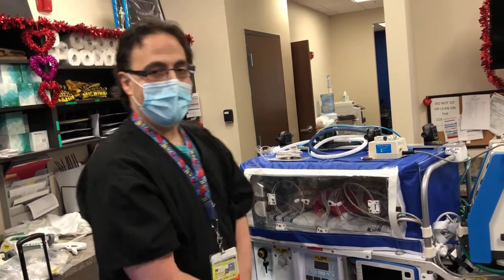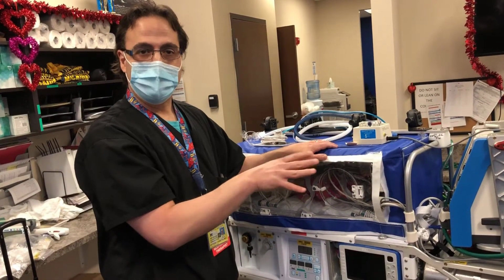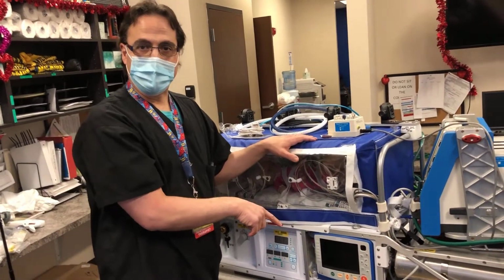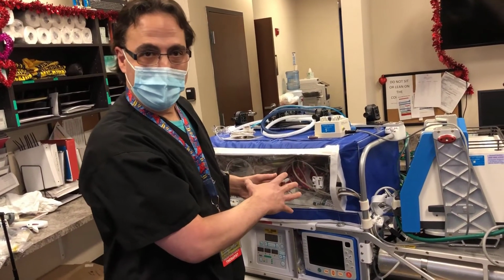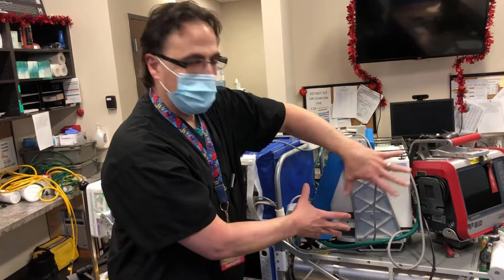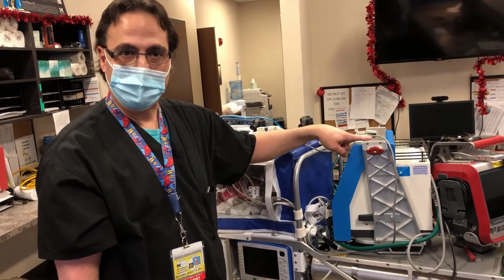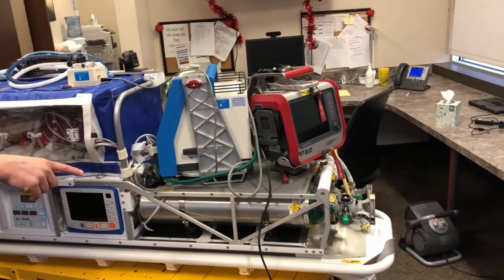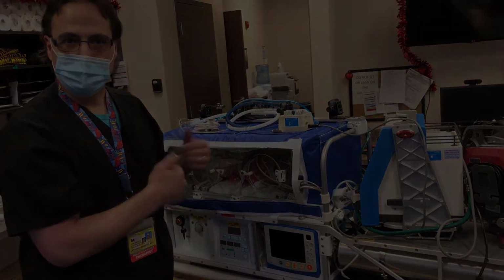The only thing I need to add is just for the RTs, once we arrive back at Brandon, Survival Flight usually does not accompany us with their fixed wing Isolette, so it will be our responsibility to strip the Isolette, clean it for them if you have the time to clean it and prep it for them. This will stay on the Isolette. You may have to move the brackets around. We're going to remove the bracket for the jet ventilator, take our jet ventilator off, and make sure the tanks are off, make sure the nitric tank has been turned off if we're using it, and send everything back the way we found it back to the LCB.